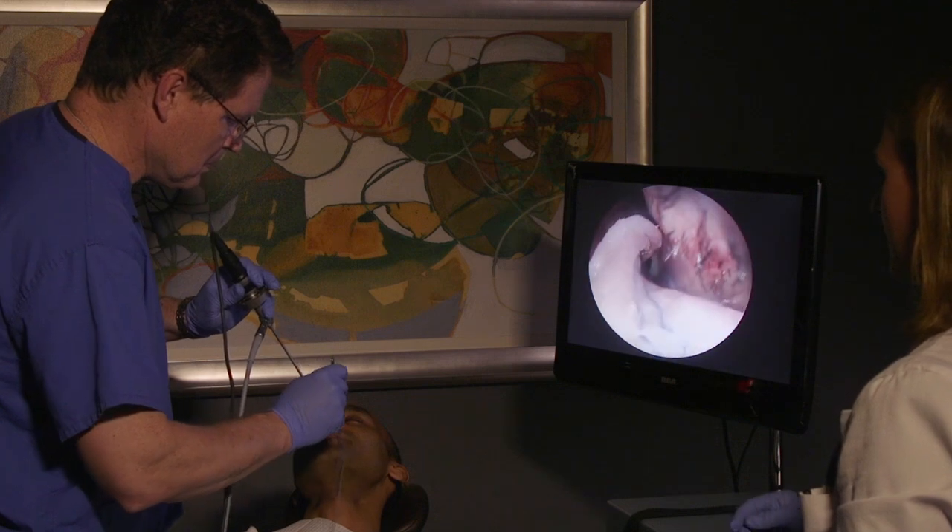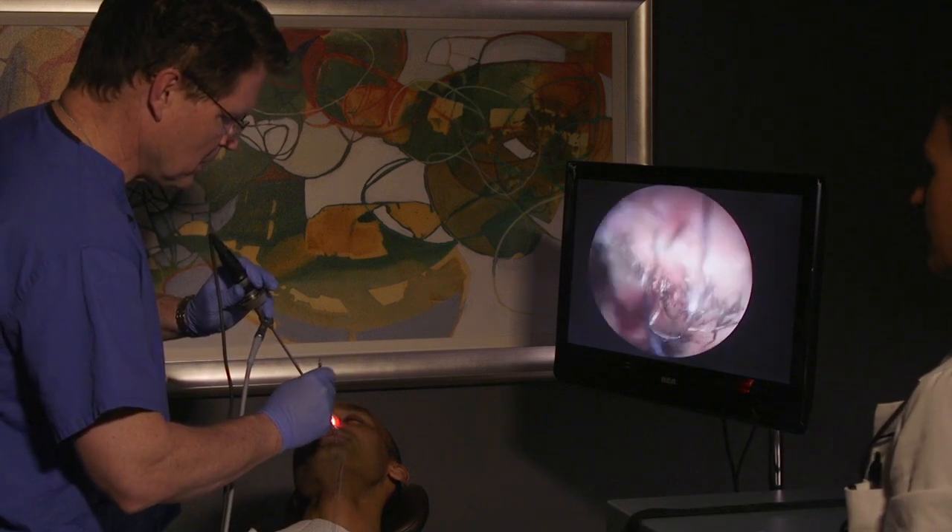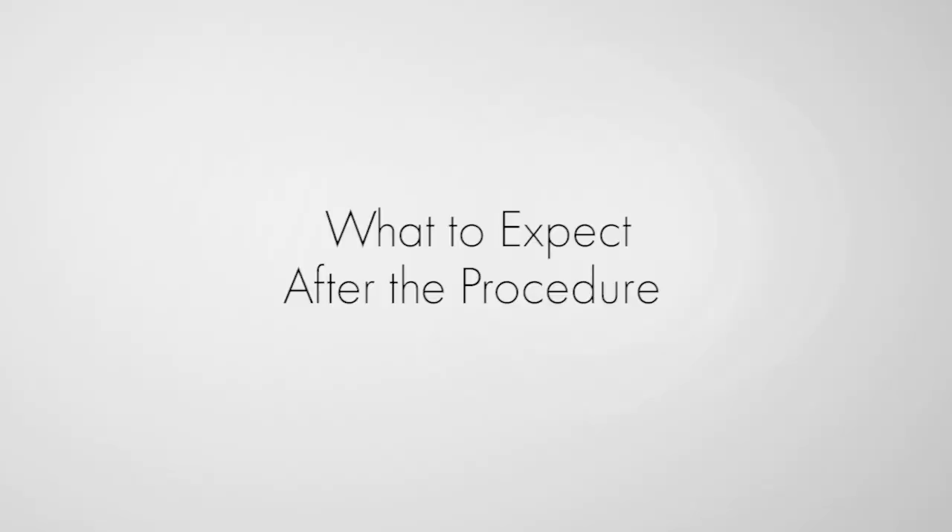All done on that side. Sneaking the cotton balls back in to make sure we're getting that numbing medicine back on the surfaces. We are all done — it's actually been done for about five minutes or so. Now sitting up, the cotton balls are sitting in my nose just to hold a little bit of pressure, and they have a little numbing medicine and decongestant to help the surfaces settle down from the procedure.